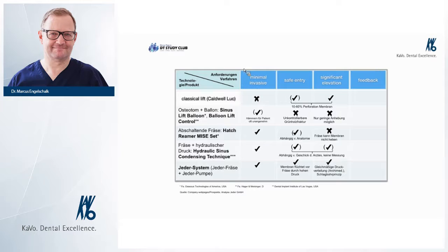Then there was a new technique using a balloon for not having a big traumatization for the membrane. But at the end, you see there is still a slight bony part you have to push with the membrane apically. This can work, but sometimes we just want to lift for one implant. Sometimes we have to lift for 3 implants, and then problems will begin.